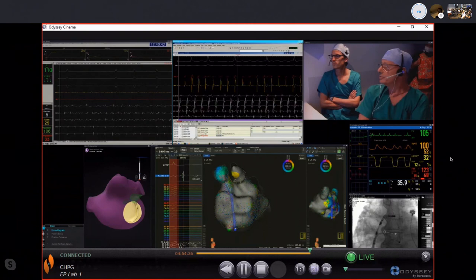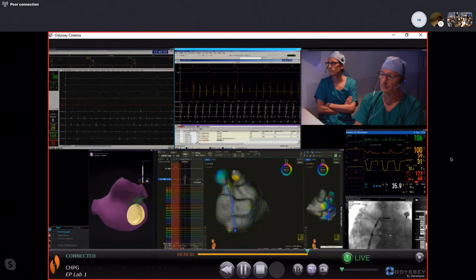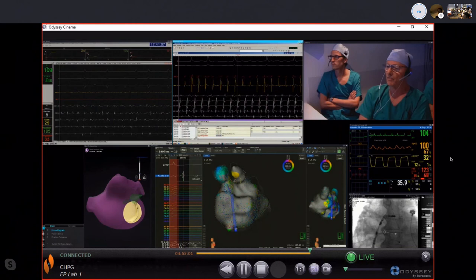So we will continue and continue to ablate, and I'm pretty confident that we will finally get rid of these tachycardias and hopefully restore sinus rhythm. Will you wait until you're back to sinus rhythm, or at some point will you say enough's enough and cardiovert and move on? Well, time will tell. Because if it's forever and if it's constantly changing, after let's say 4 or 5 hours, we will stop and not cardiovert. We'll wait, because in our experience, very often sinus rhythm spontaneously resumes in the hours that follow, and the patient may then stay in sinus rhythm for a very, very prolonged period. So we will not shock, no.